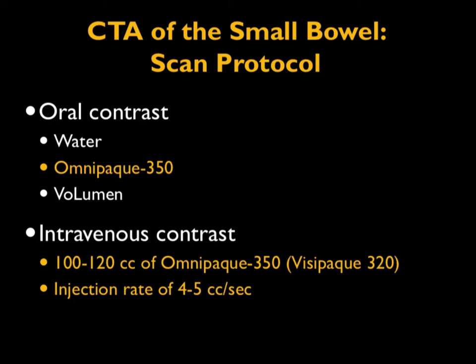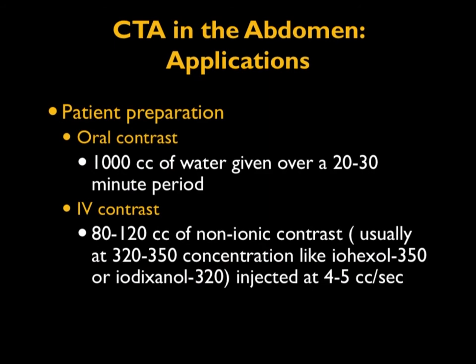We always use IV contrast, and we're going to use 5 cc's per second, 100 to 120 cc's of Omnipaque or Visipaque. In terms of the protocols, if I'm giving water, 1,000 cc's over about 20 to 30 minutes works well. And again, as I noted, those are the injection rates we like to use.